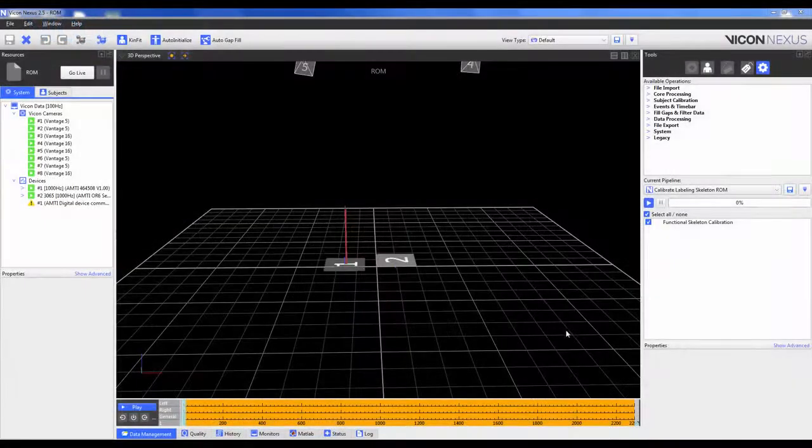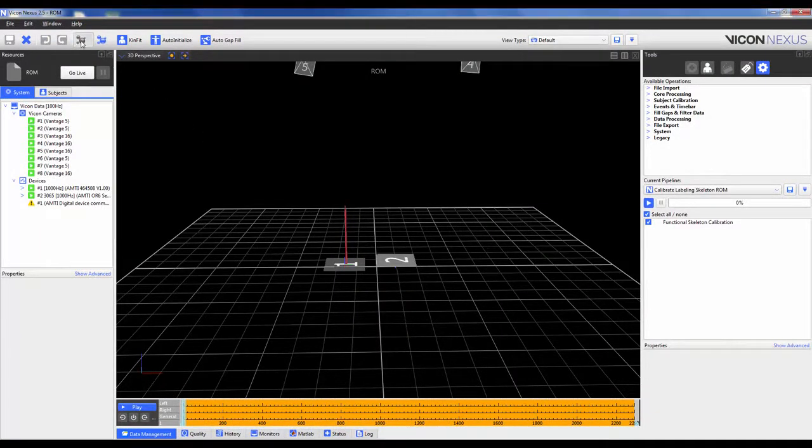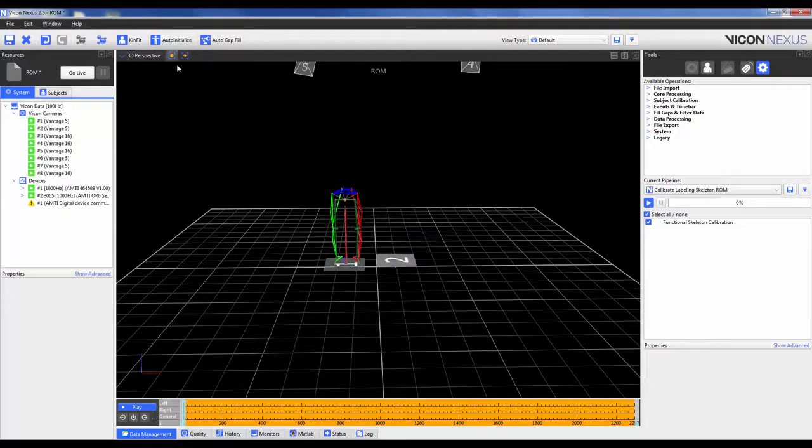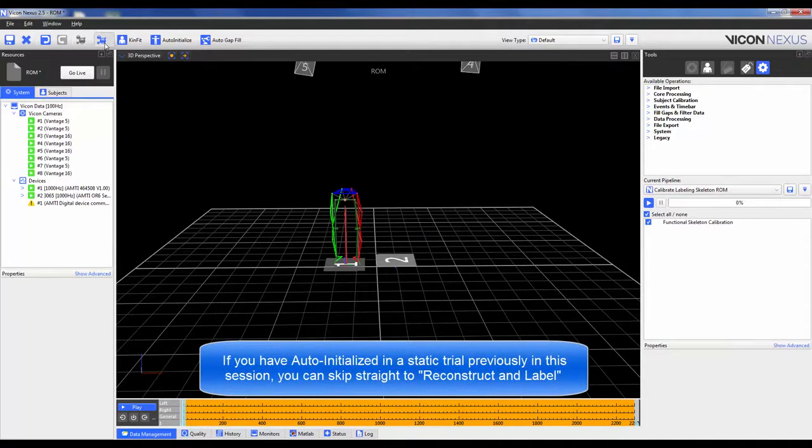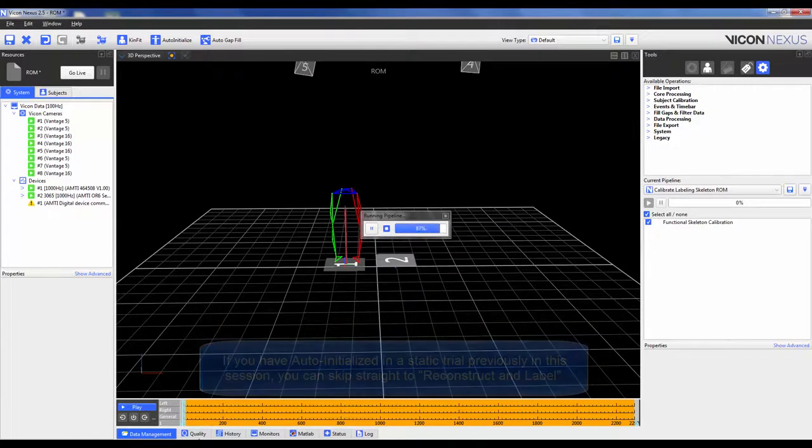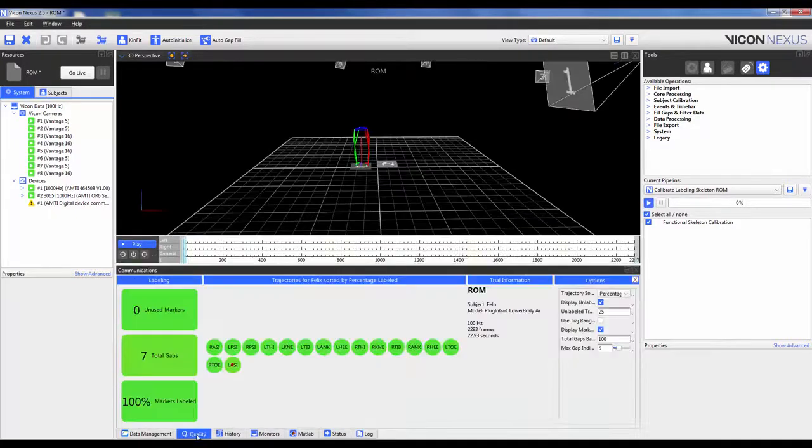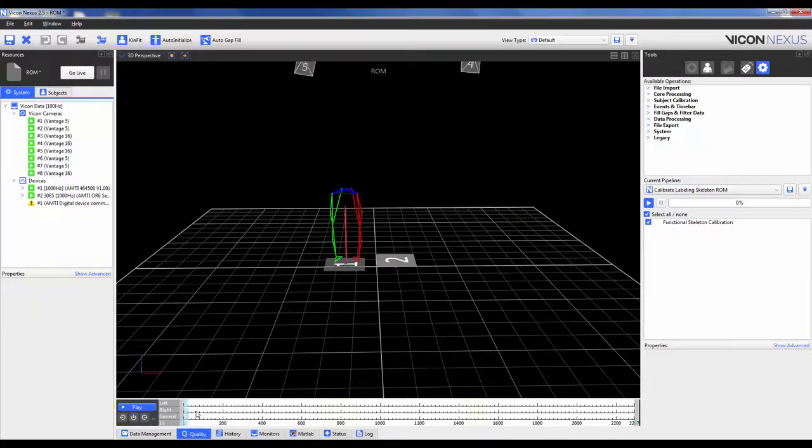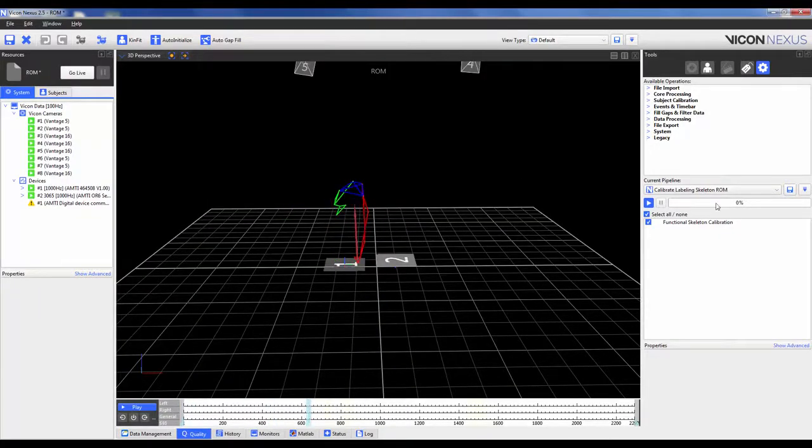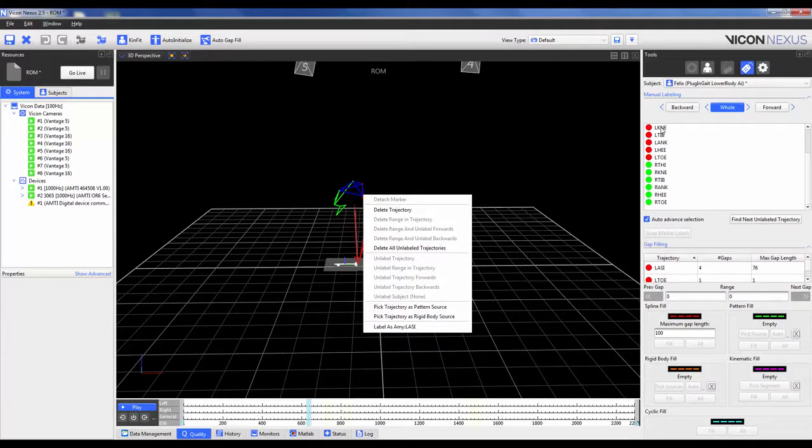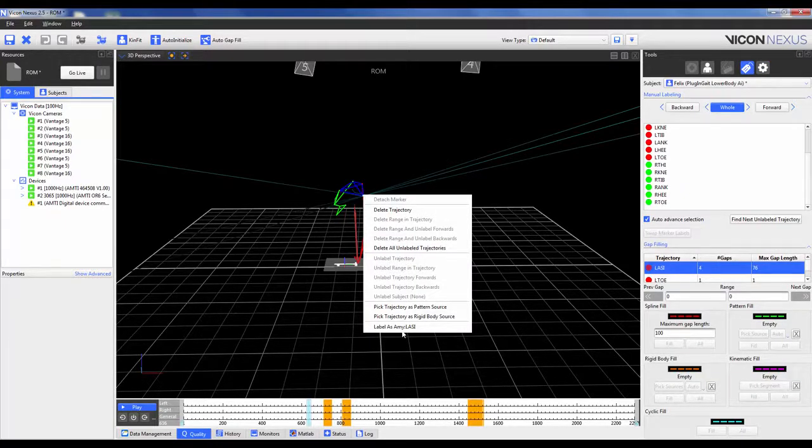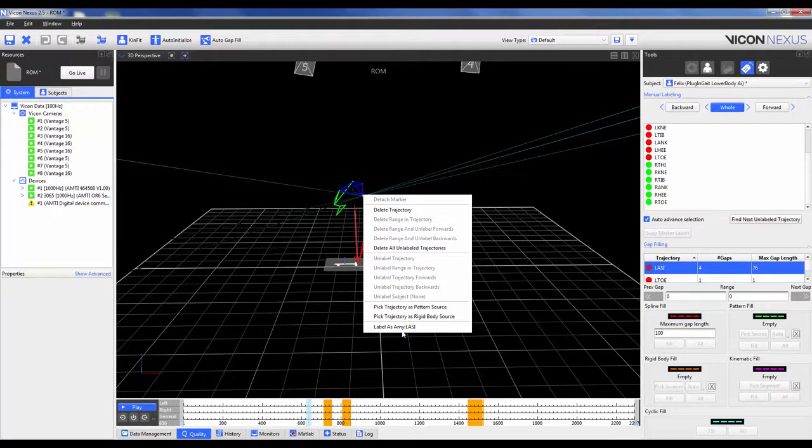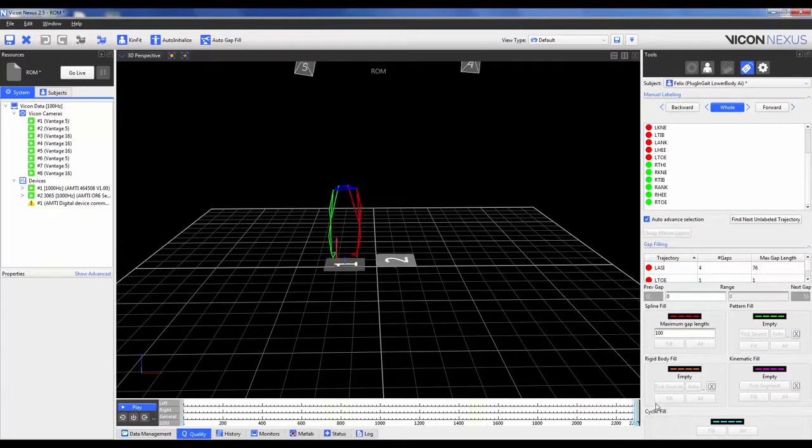To process the ROM trial, go ahead and open it and replicate the steps for the static trial, that is to reconstruct and then auto-initialize. We're going to add in an extra step here, which is to then reconstruct and label. We can then quickly go into the Quality tab and look to see if any of our markers are labeled. If they were, we can go ahead and scrub through the trial and apply the labels within either label edit or right-clicking on the marker and then go into the bottom of the list and see which marker was not labeled.